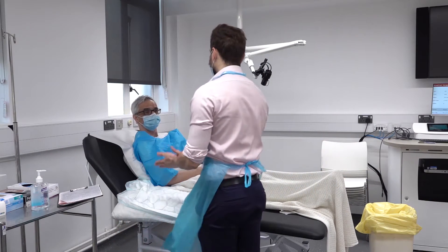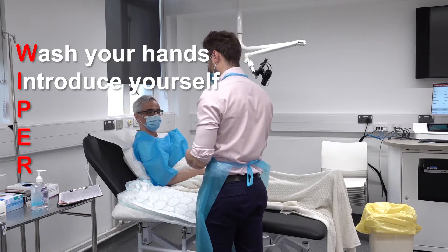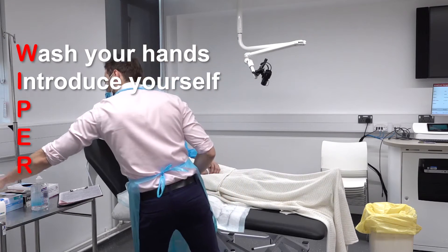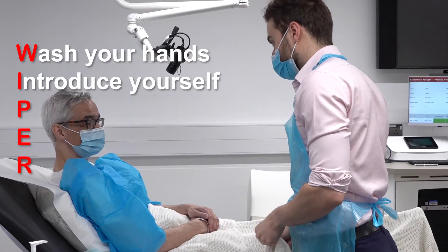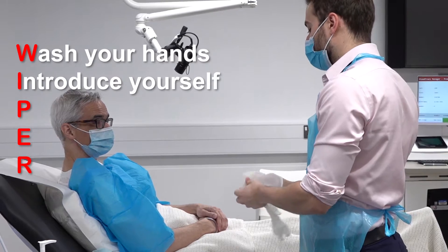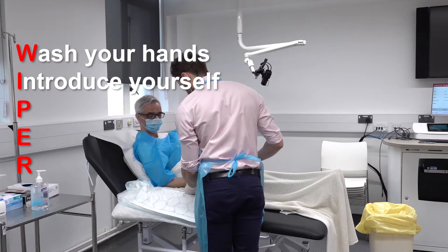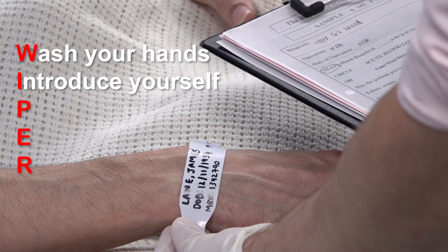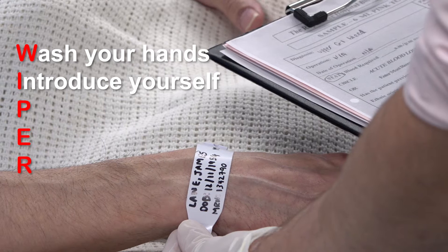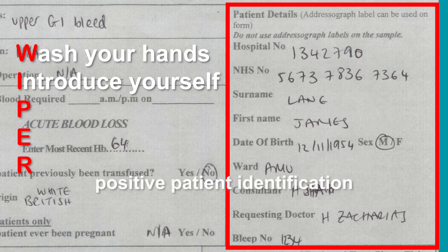Before starting the procedure, perform WIPER. Wash your hands and introduce yourself to the patient. The patient must give you their full name, which should be spelt if uncertain, and their date of birth. If the patient is not able to do so, then an additional form of verification should be used, for example the identification on the patient's notes. This must then be checked against their wristband, which must also be checked against the request form including the full name, date of birth, and hospital number. This process is called positively identifying the patient.